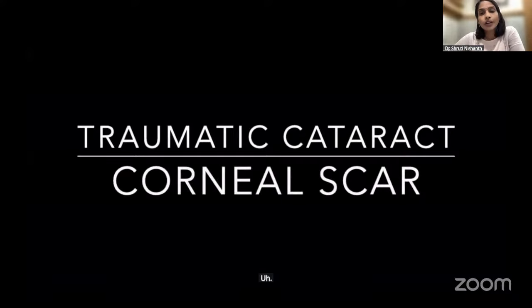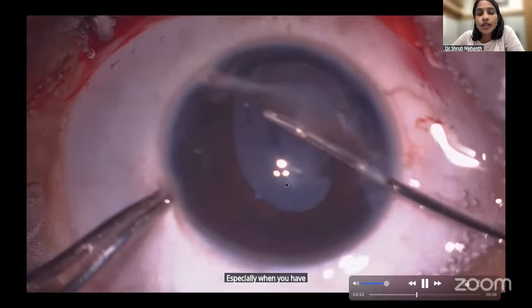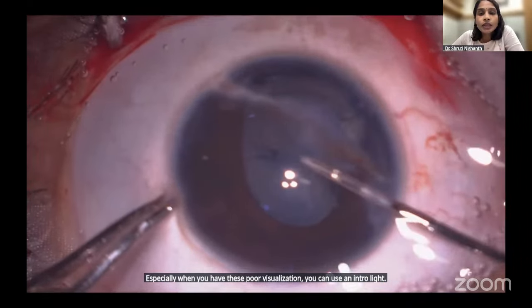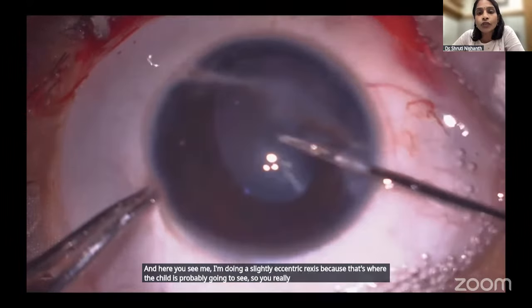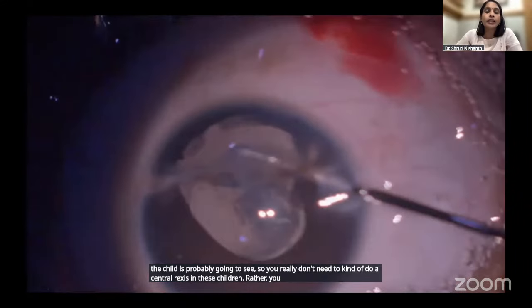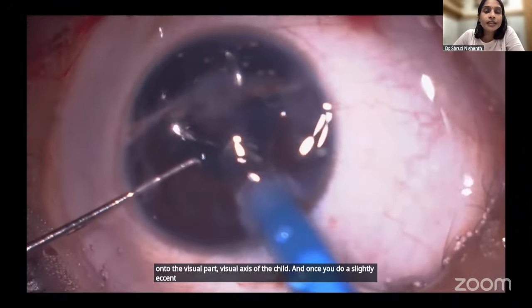What do you do when you have traumatic cataracts? Dr. Jyoti spoke really beautifully about several scenarios, and what happens in rhexis in these cases, especially when you have poor visualization. You can use an endolight. Here you see me doing a slightly eccentric rhexis because that's where the child is probably going to see. So you really don't need to do a central rhexis in these children. Rather, you would like to center your rhexis onto the visual axis of the child. And once you do a slightly eccentric rhexis, you can just go ahead and put an IOL.